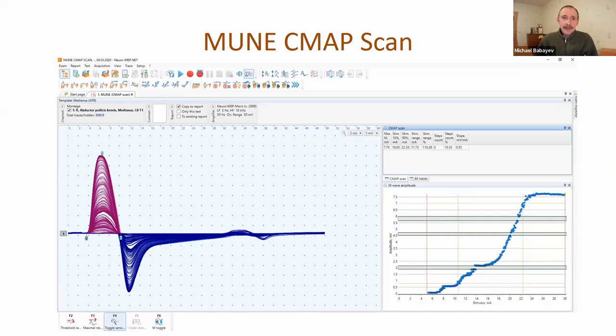Another technique: MUNE-CMAP scan. Now we have four different techniques for motor unit number estimation. First is incremental MUNE. Second is MAP decomposition - motor unit potential decomposition. Third is MUNIX, which is very popular now. And the fourth is MUNE-CMAP scan. In this technique, we apply a lot of stimuli to the nerve - usually 500 stimuli - changing the stimulus intensity from supramaximal down to the threshold. We record a lot of M-waves and then analyze the graph and the gaps visible in it.